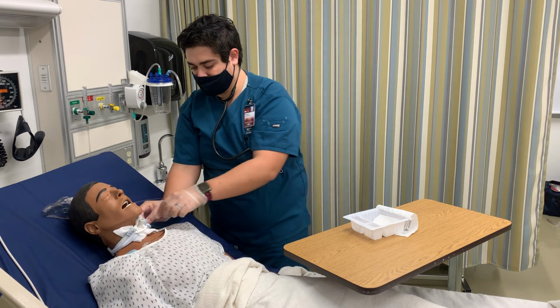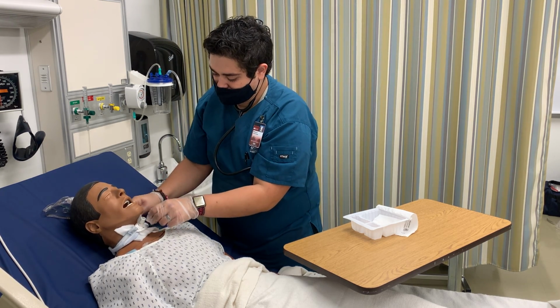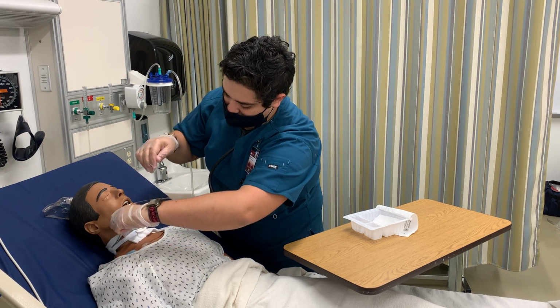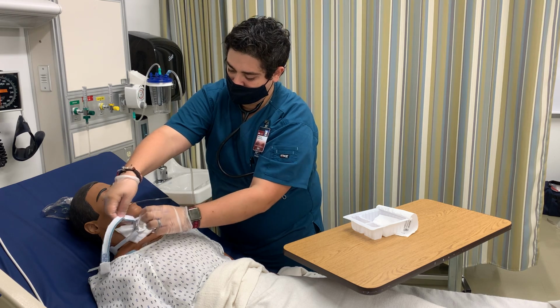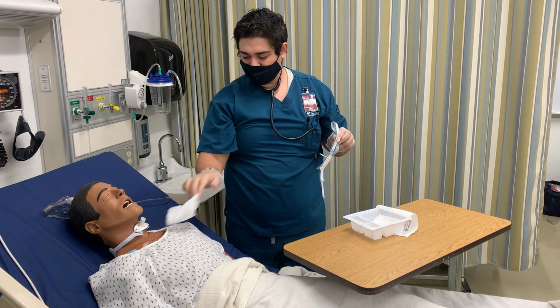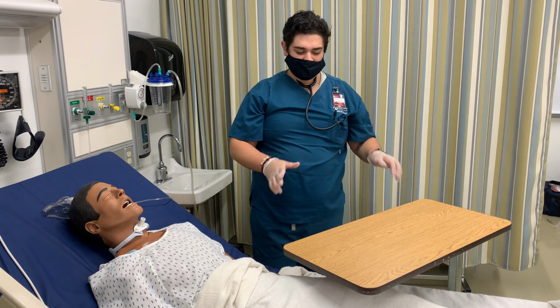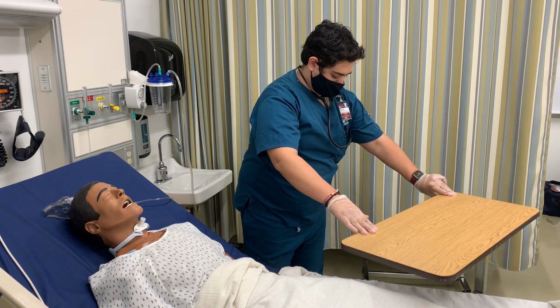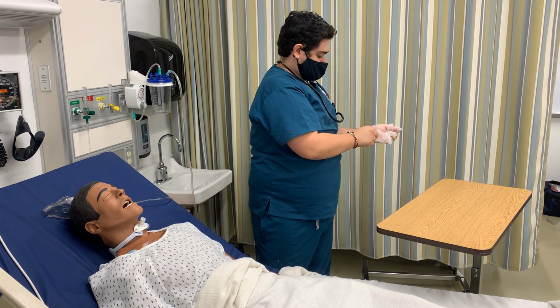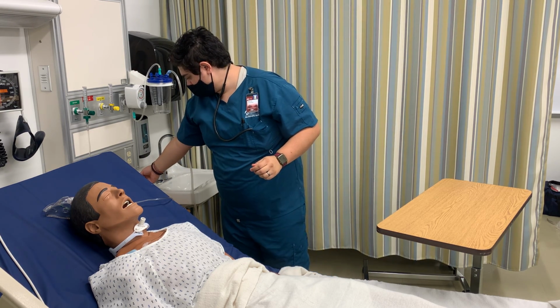Okay, that's securely attached. Now I could remove my old ties here. Disposing that and my gauze. Throwing away all my equipment. Okay.